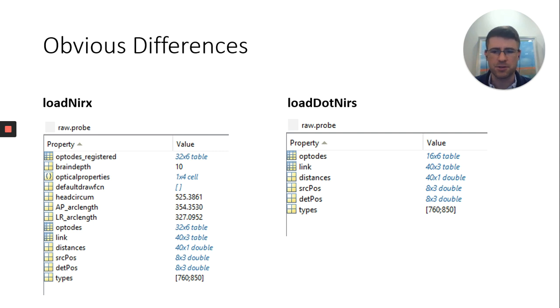So you'll see optodes registered, brain depth, optical properties, default draw function, which is actually what we're going to talk about today, head circumference, AP, which is, I believe, anterior posterior arc length. So the arc that goes that way, left to right arc that goes that way. And then following that, finally, you have the same information going from optodes down as the loadDotNirs function.